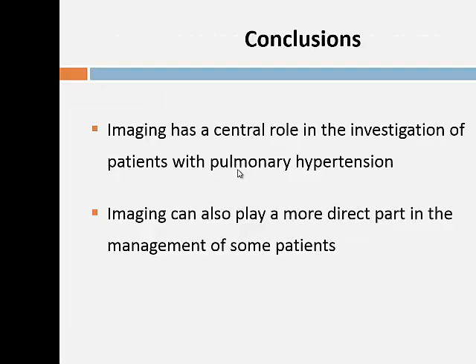The last thing to say is imaging is really important in patients with breathlessness, and you've got the whole gamut of imaging from echo to chest radiograph to CT to MR to even angiography, and you have to think your way through, doing certain things in a certain order. But the most important thing, certainly for radiologists, is if you see a dilated right heart that doesn't fit with what else you're seeing, think about shunts, think about weird things like pulmonary arterial hypertension.